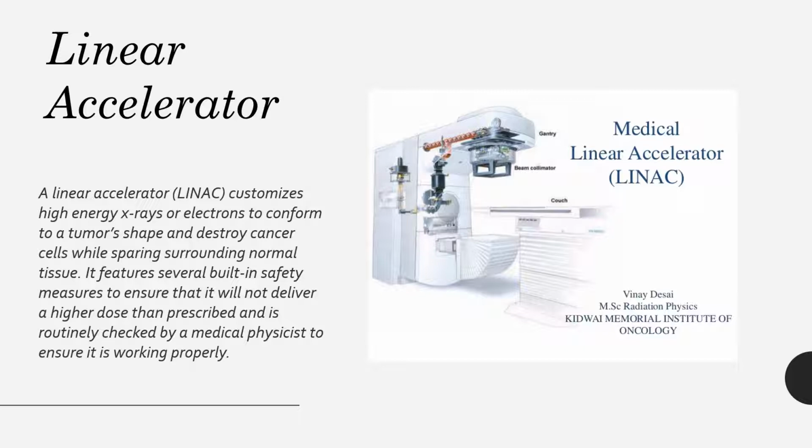A linear accelerator is most commonly used for external beam radiation treatments for patients with cancer. It's used to treat all parts and organs of the body. It delivers high-energy X-rays or electrons to the region of the patient's tumor. These treatments can be designed in such a way that they destroy the cancer cells while sparing the surrounding normal tissue. And a LINAC is used to treat all body sites using conventional techniques: intensity modulated radiation therapy, volumetric modulated arc therapy, image-guided radiation therapy, stereotactic radiosurgery, and stereotactic body radiotherapy.